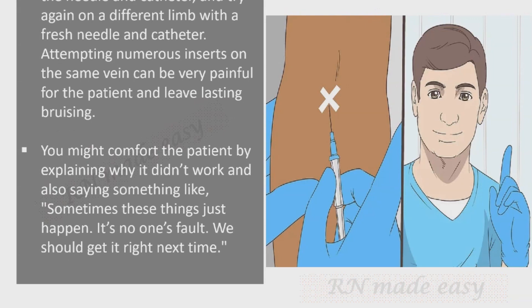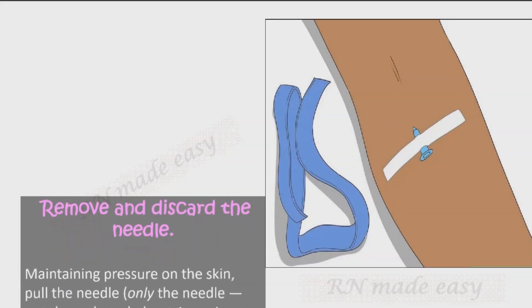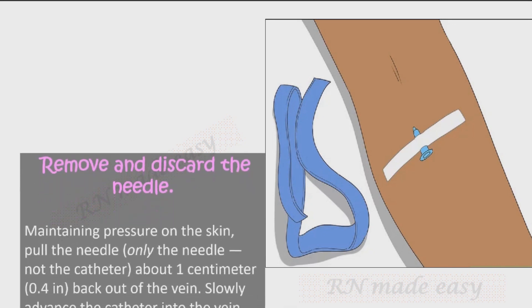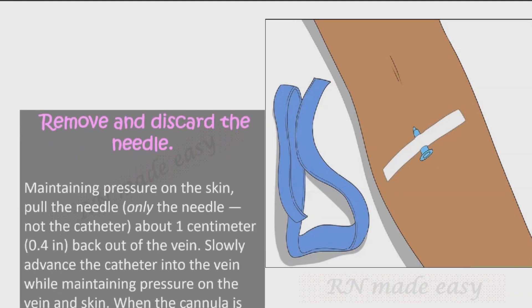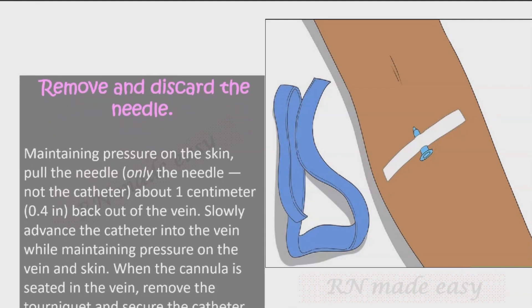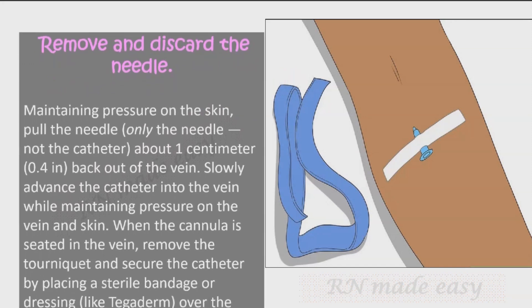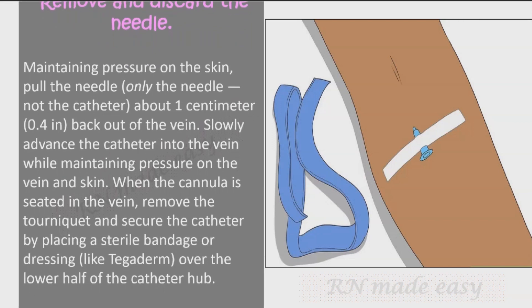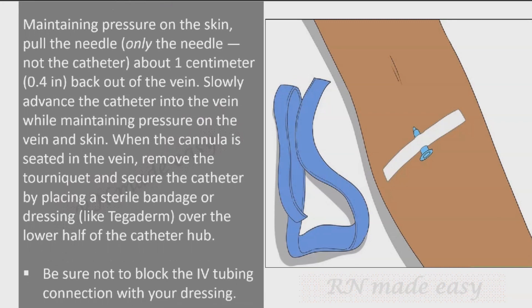Remove and discard the needle. Maintaining pressure on the skin, pull the needle — only the needle, not the catheter — about one centimeter (0.4 inches) back out of the vein. Slowly advance the catheter into the vein while maintaining pressure on the vein and skin. When the cannula is seated in the vein, remove the tourniquet and secure the catheter by placing a sterile bandage or dressing like Tegaderm over the lower half of the catheter hub. Be sure not to block the IV tubing connection with your dressing.